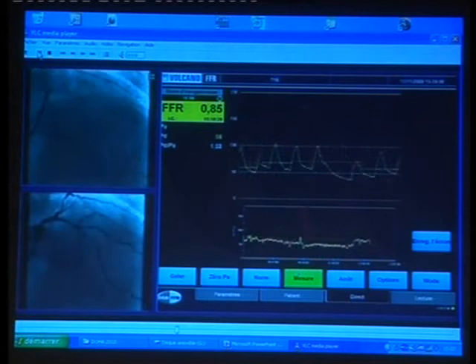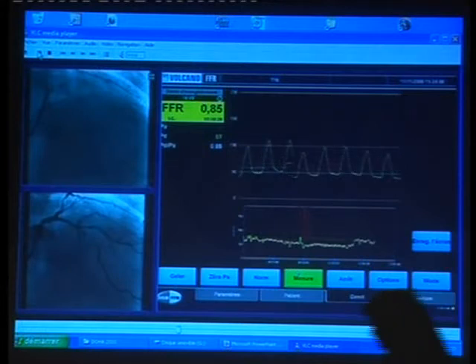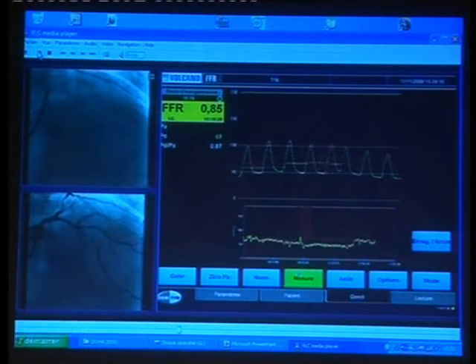So it's important, Bruno, after normalization of the two pressures, you advance, you pass the lesion with your wire, and now we look at the baseline pressure. Is there a delta or not? 0.9. It's a mild gradient at basal state. It's mild. We'll see after injection of adenosine.